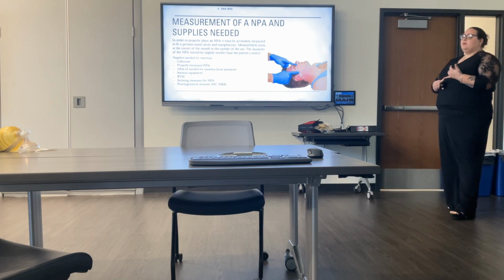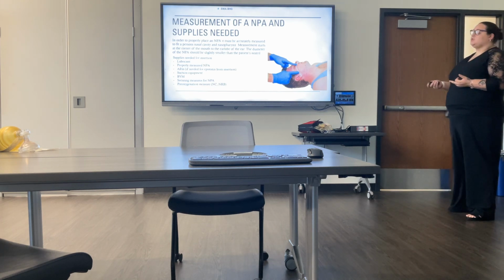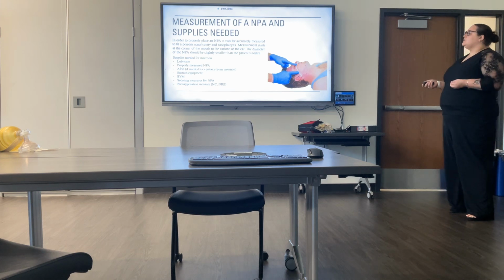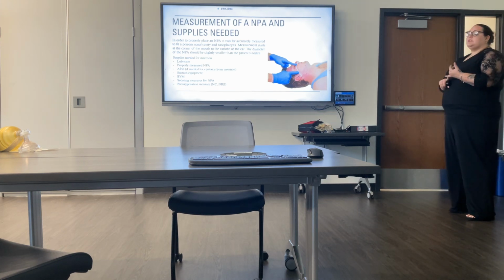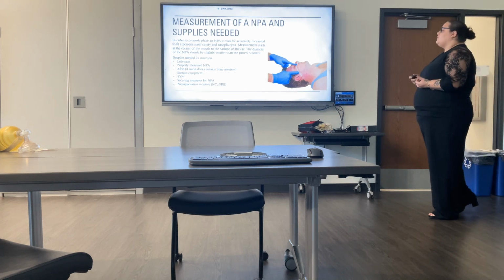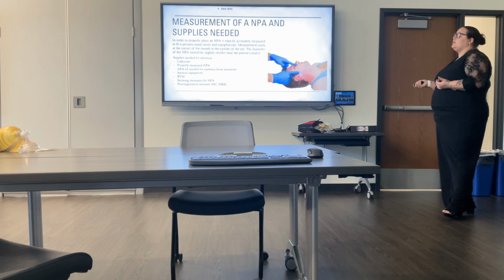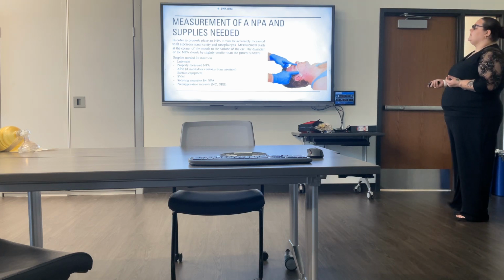You need your lube and a properly measured NPA. You need Afrin, in case you cause trauma and cause nasal bleeding due to the vascularity of the nose. You need suction equipment, whether your patient is already actively vomiting from the head injury or from the fact that it causes them to vomit. You need to be prepared for that to reduce aspiration risk.